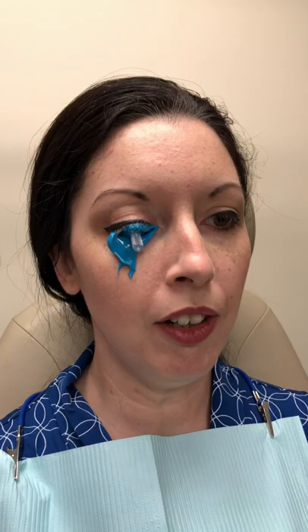We inserted the mold already and we're just letting it dry right now. I'm not in any pain — I barely feel anything in my eye. We're just gonna wait here until the mold solidifies. When it solidifies we can take it out and send it to the company. That mold will then be used in a 3D printer to create my own customizable lens.